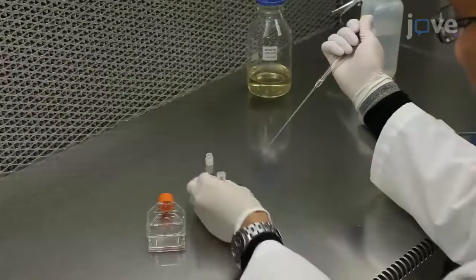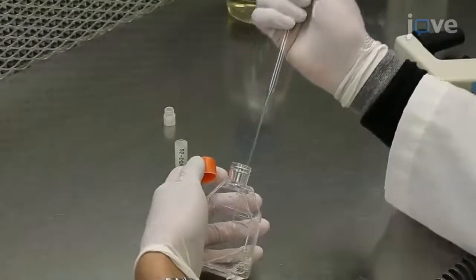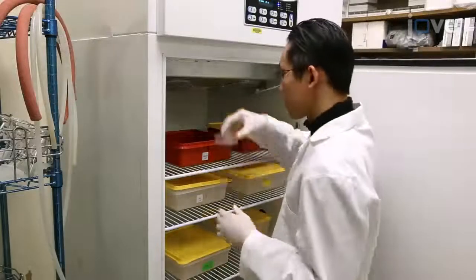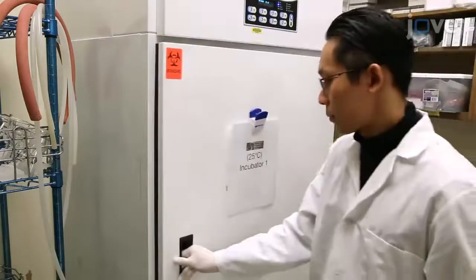Transfer the entire volume of the thawed cell suspension to the flask and rinse the cryovial with fresh medium. Allow the cells to settle to the bottom of the flask for at least 2 hours in a 25 degree Celsius incubator.